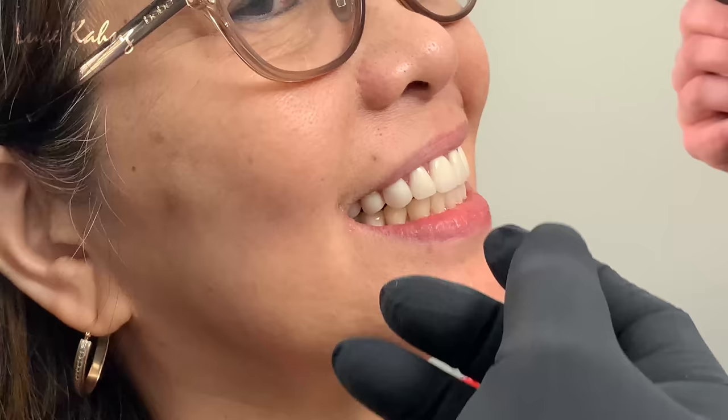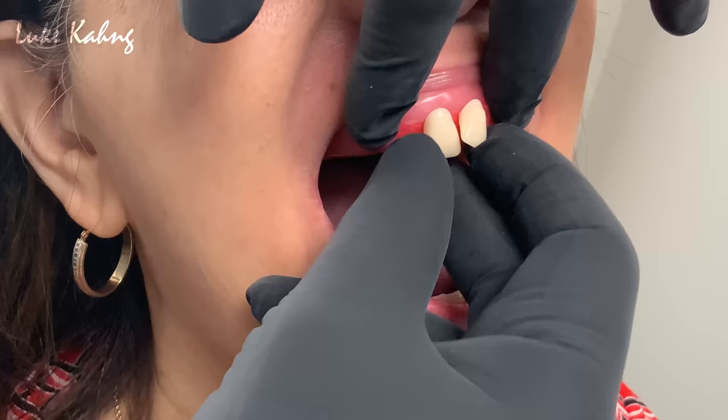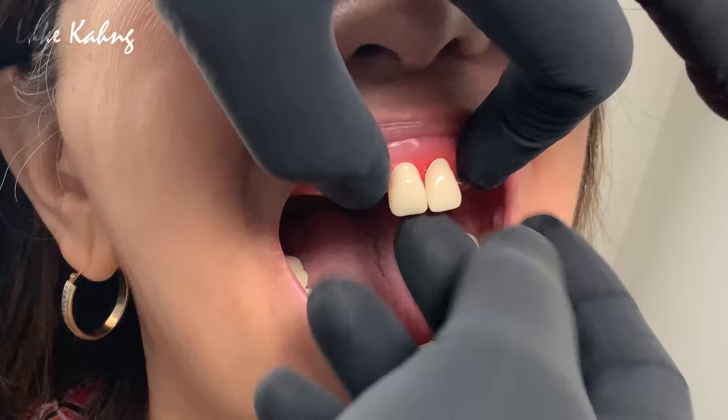Good. Nice, right? So this is the Howard bite block, and then we usually put it into the patient. That's what we're trying to create, about two teeth from the central, right? I'm sorry. Thank you. Put it very tight. Okay, open. So we're trying to set up like this. This is the 101 denture setup from the tools, okay? This is denture setting. Take the shot. Go ahead.